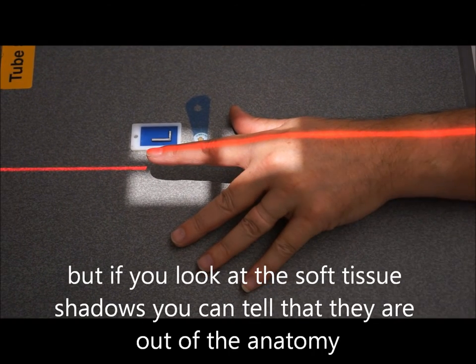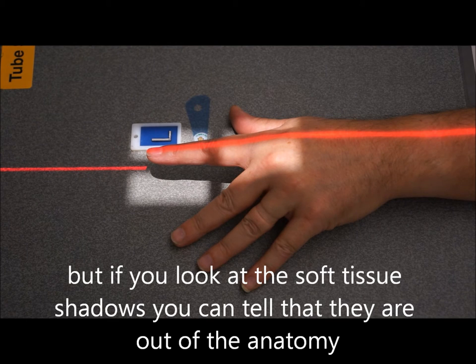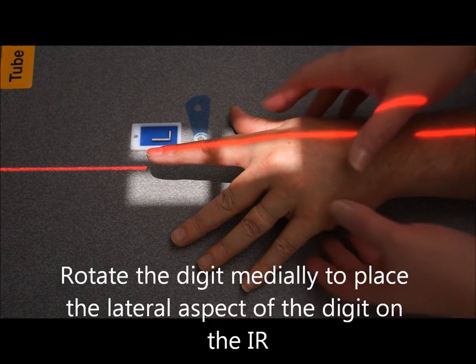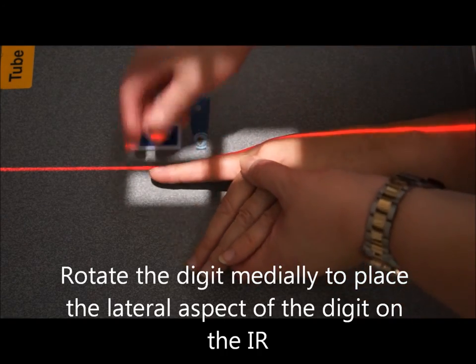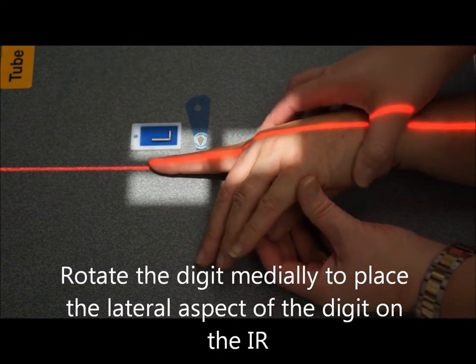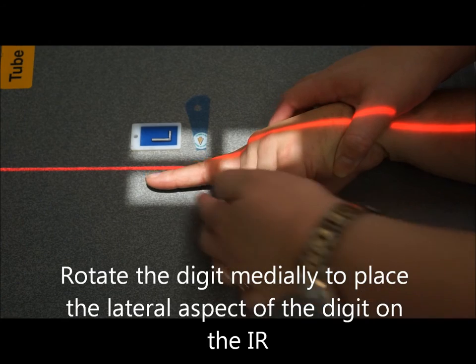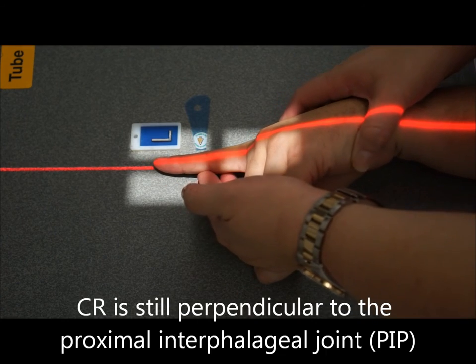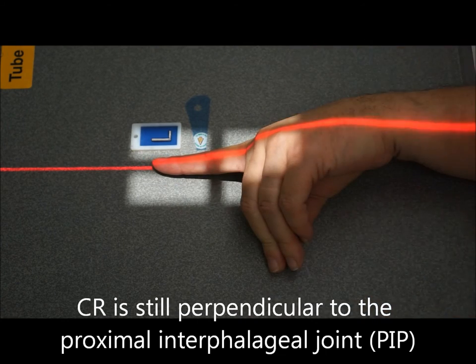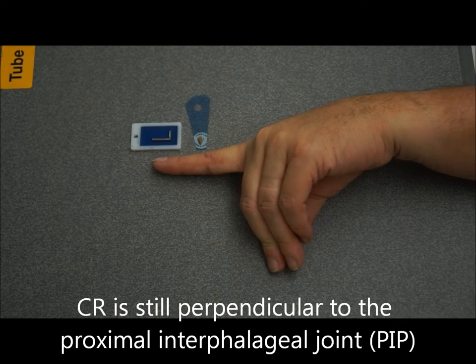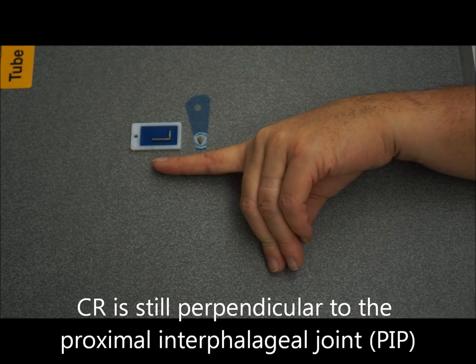And then from here we're going to go into a lateral. Now on the lateral it's a medial rotation. We want to make sure we keep the thumb out of the area of interest, other digits out of the way. Central ray still at the proximal interphalangeal joint. Nice true lateral.